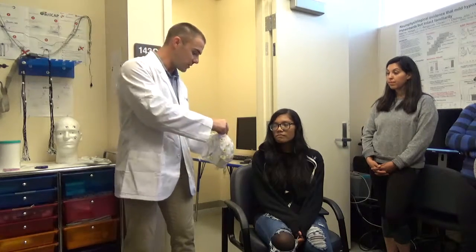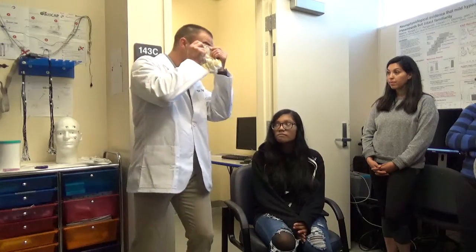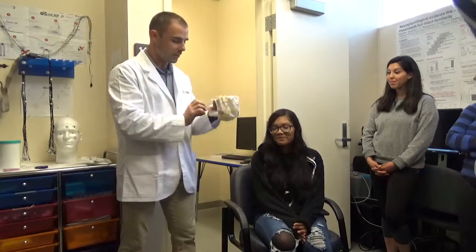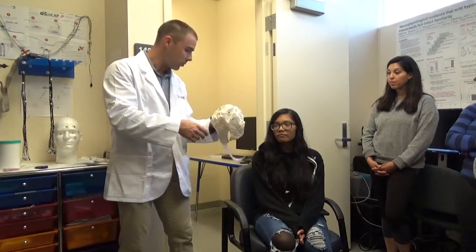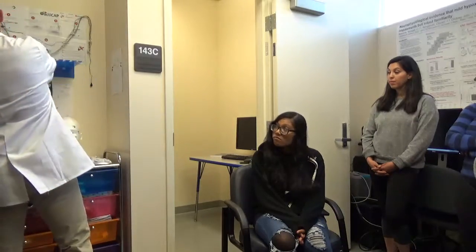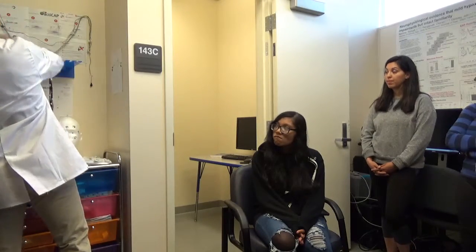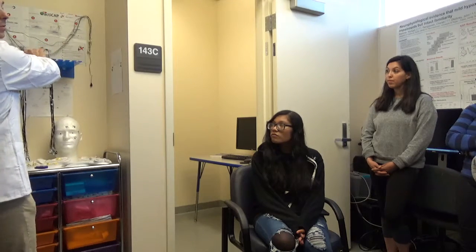So these are just little plastic nodules, and you can let them look at it and say it's just empty stuff, and you can kind of see through it. And they'll have a little chin strap, and you put your ears in the side and make it comfortable. And these will hold our electrodes in place. And then we want to show them our actual electrode rig, which we keep here. And there's a reason that we keep it up here in this way, okay?